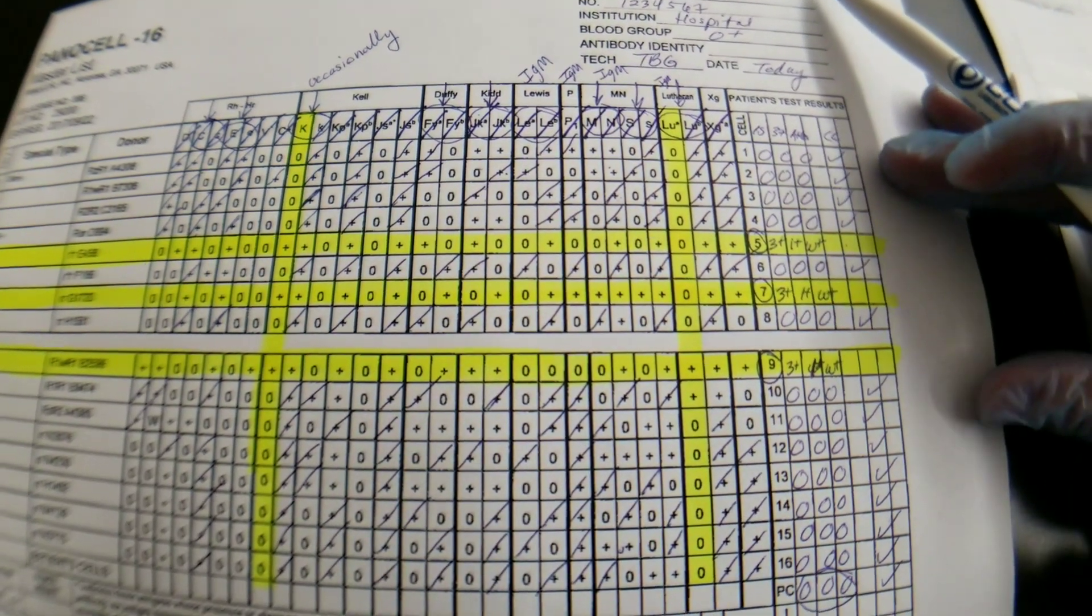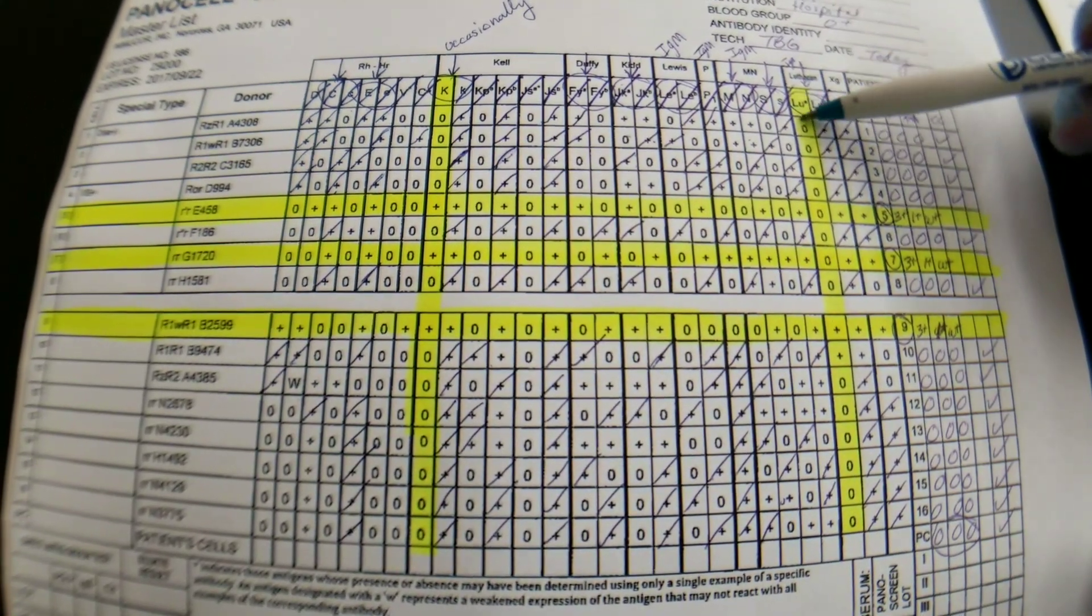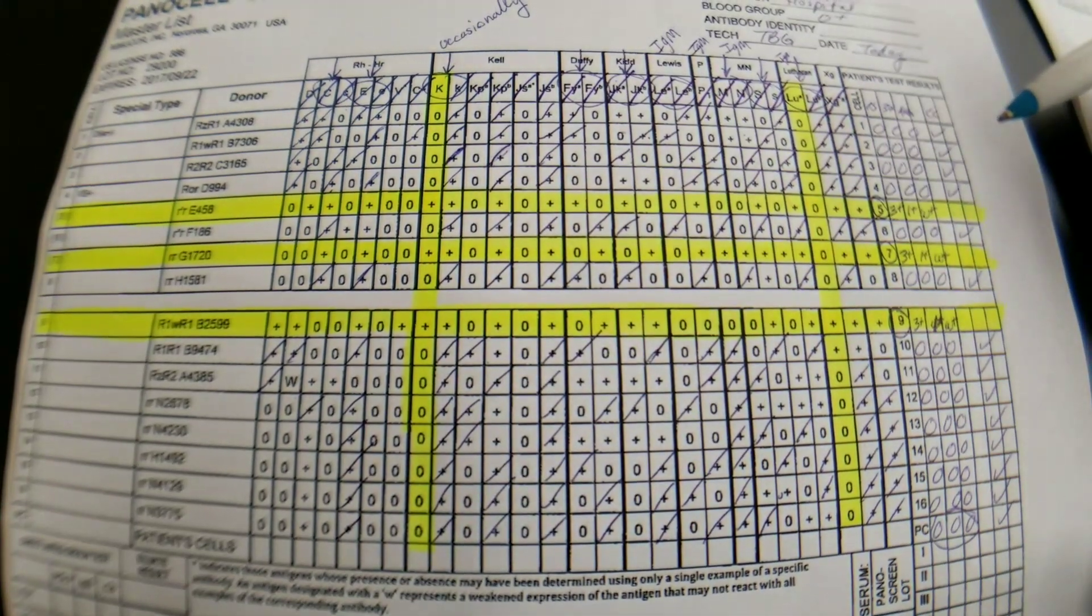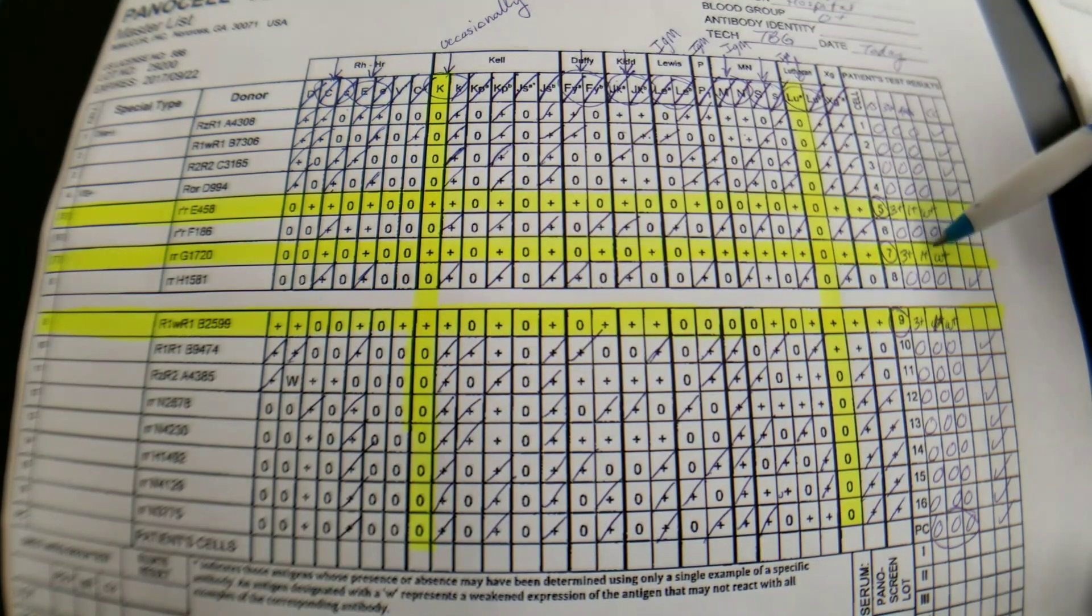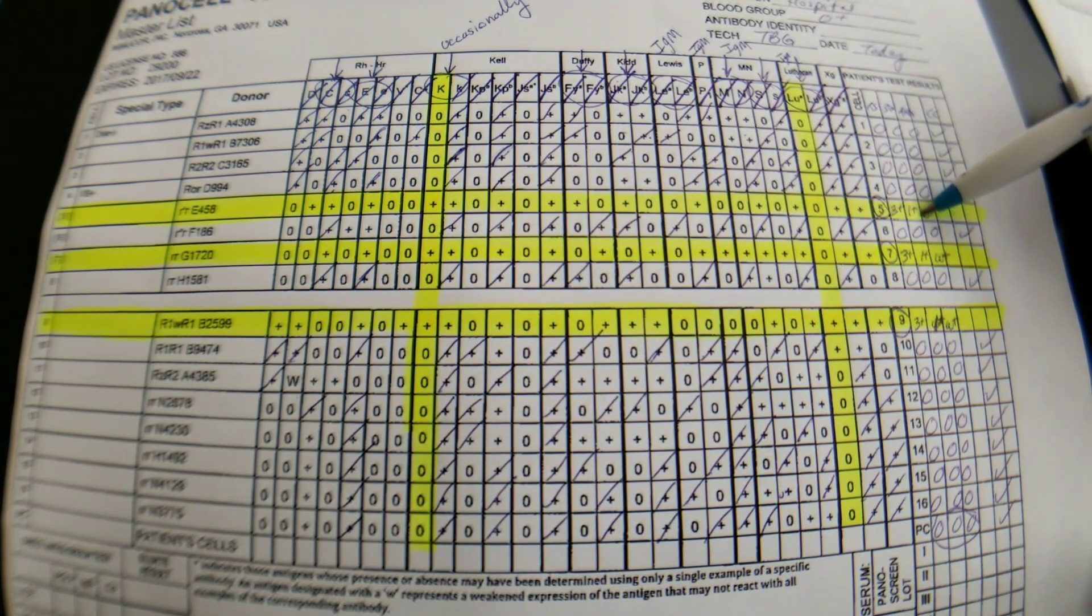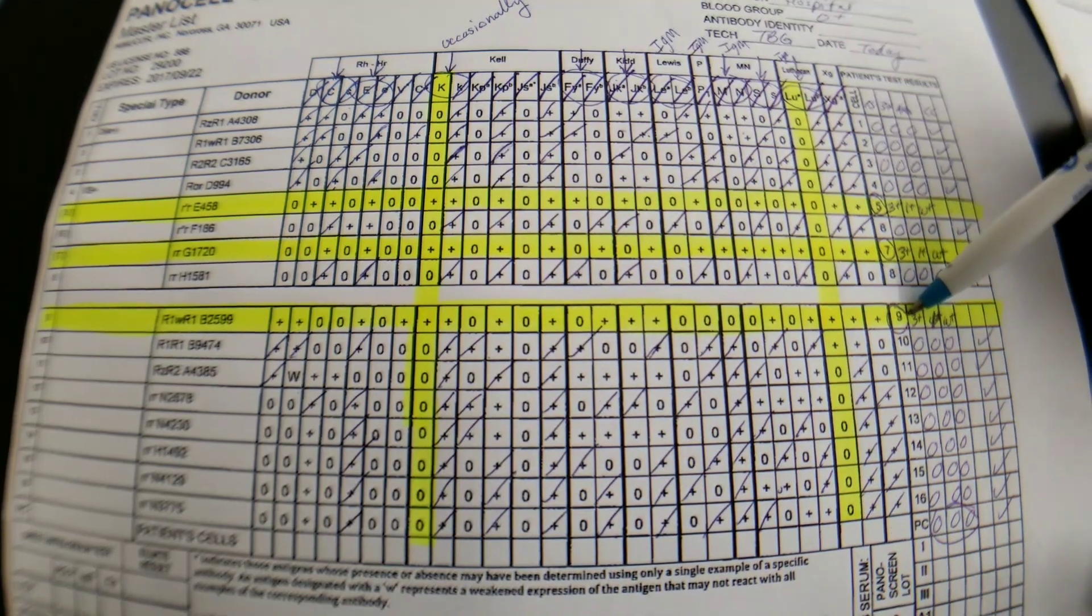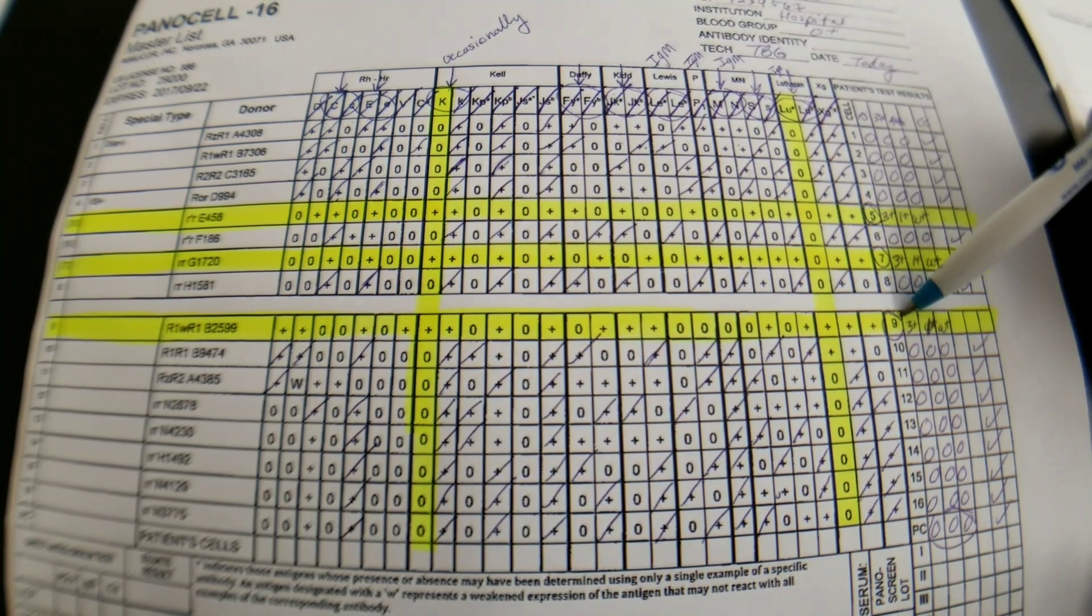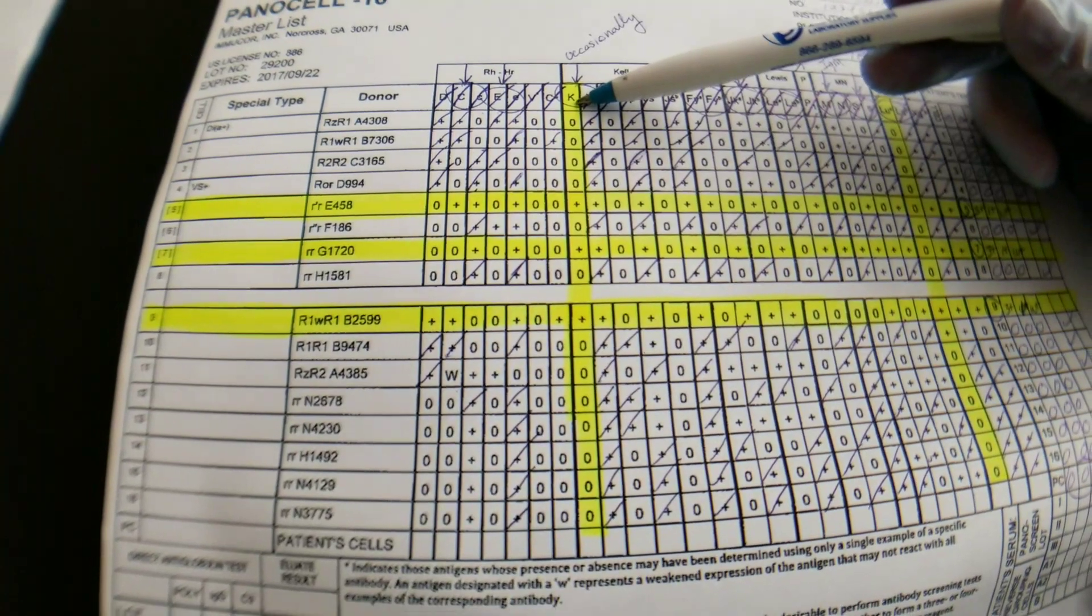Now, the pattern that we're looking for is we want to find out of the two highlighted columns, because these are the ones that we could not rule out, we want to find which ones actually match the positivity pattern over here. So we're looking for one that is only positive in cell 5, 7, and 9. So can you see that one? I'm sure you already know which one it is. So let's look left to right. Okay, so we're at Kel here, also known as Big K.